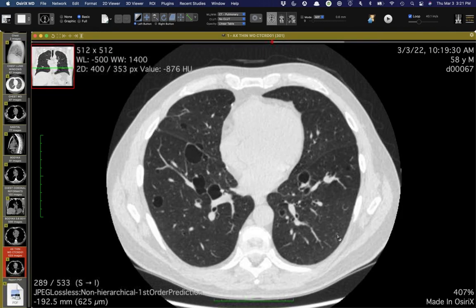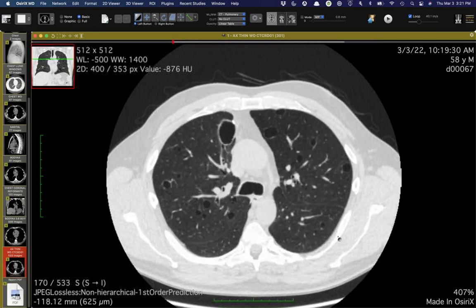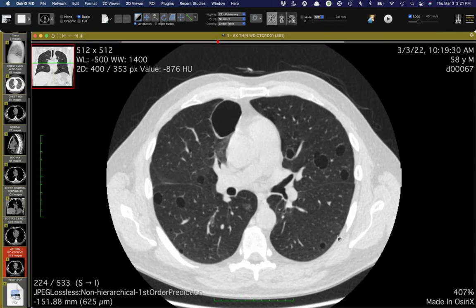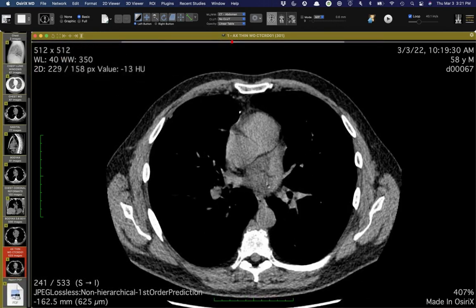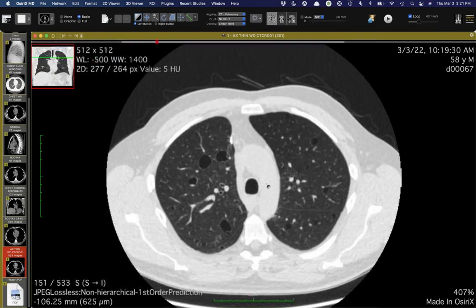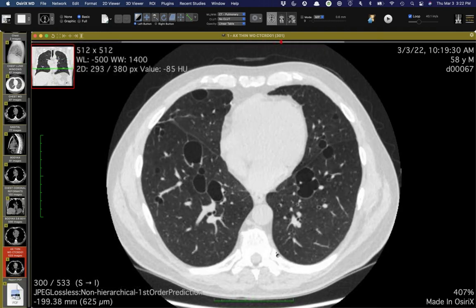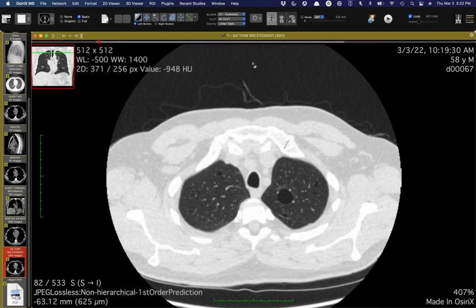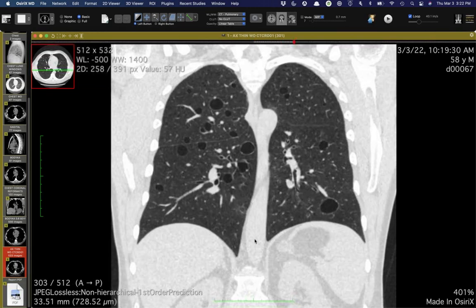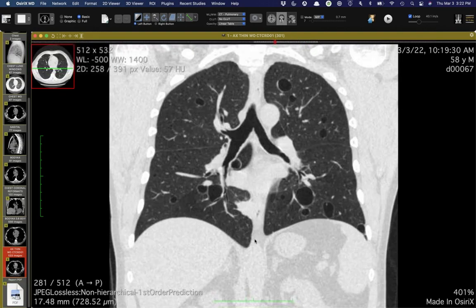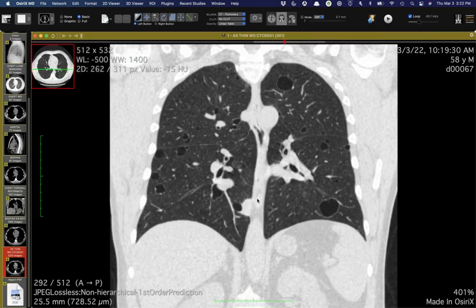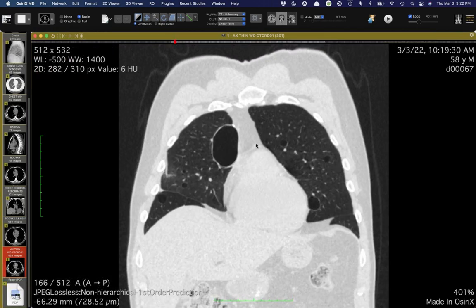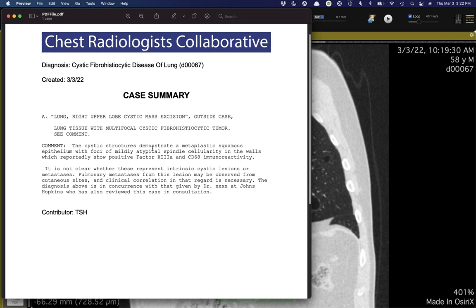Most of the cysts are spherical, some have perivascular findings. This is a genetically XY patient. There's no calcium or ossification in any of these cysts — I was discussing with my fellow whether this could be light chain deposition disease. They're pretty diffuse. No renal disease, no skin disease that we know of. The surgical pathology — confirmed at Hopkins in 2012 as well — was multifocal cystic fibro-histiocytic tumor, which was a new one for me.